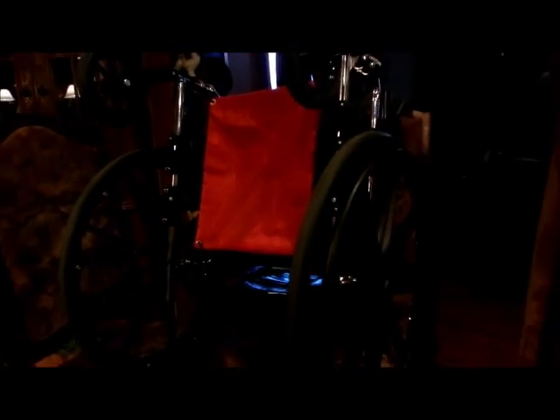Now, if you need some help, or if you could do it yourself, put your chair up to where you can get access to the bottom of the chair. All right. If you need to take your wheelie bars off, go ahead and do that. I don't have wheelie bars, so they're not on there.